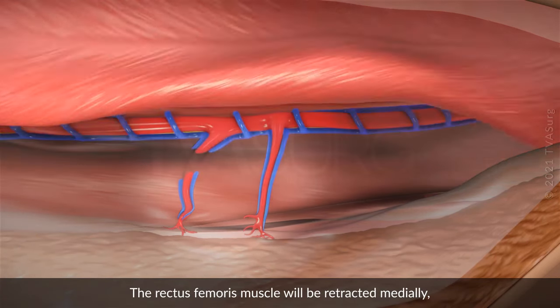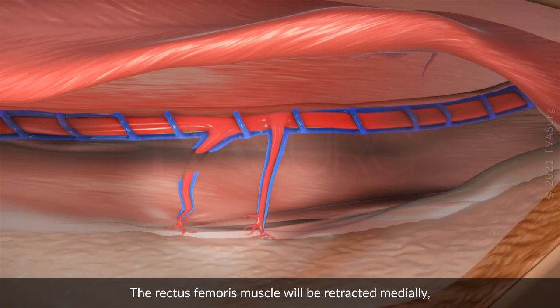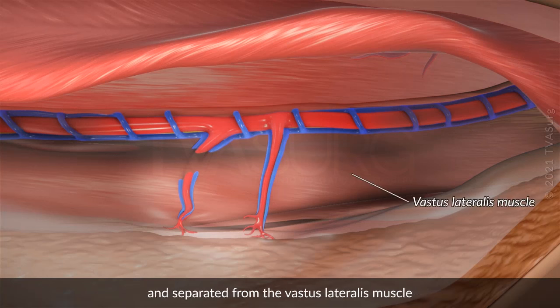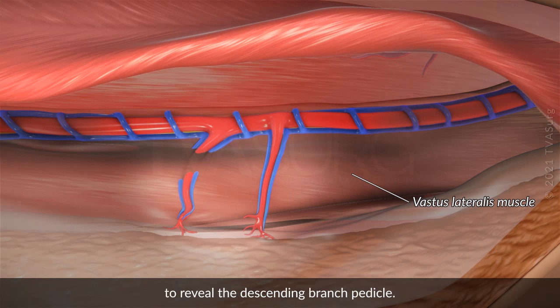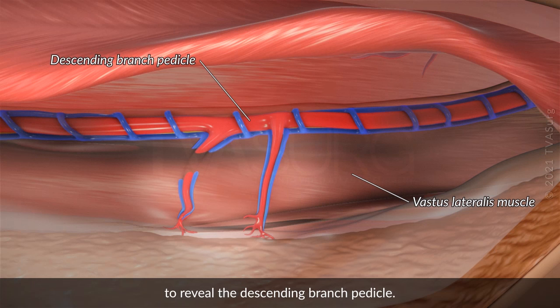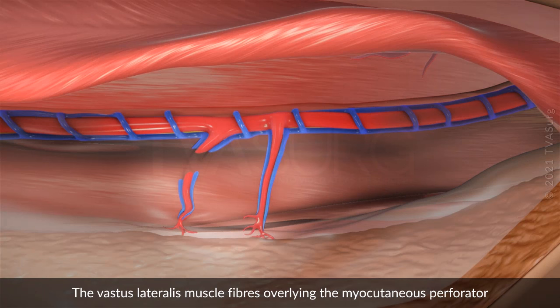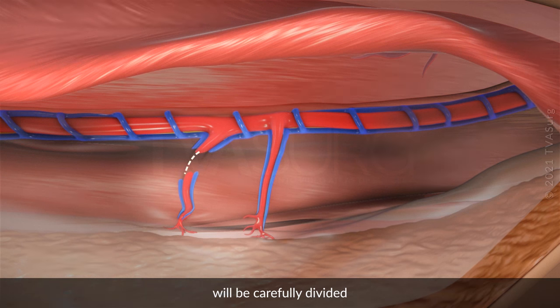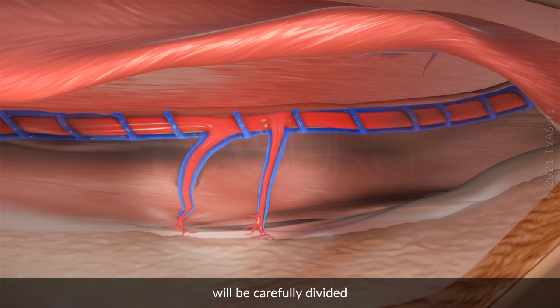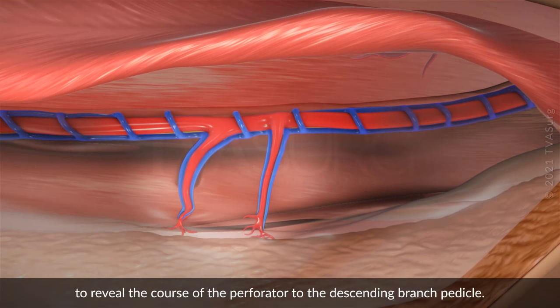The rectus femoris muscle will be retracted medially and separated from the vastus lateralis muscle to reveal the descending branch pedicle. The vastus lateralis muscle fibers overlying the myocutaneous perforator will be carefully divided, to reveal the course of the perforator to the descending branch pedicle.